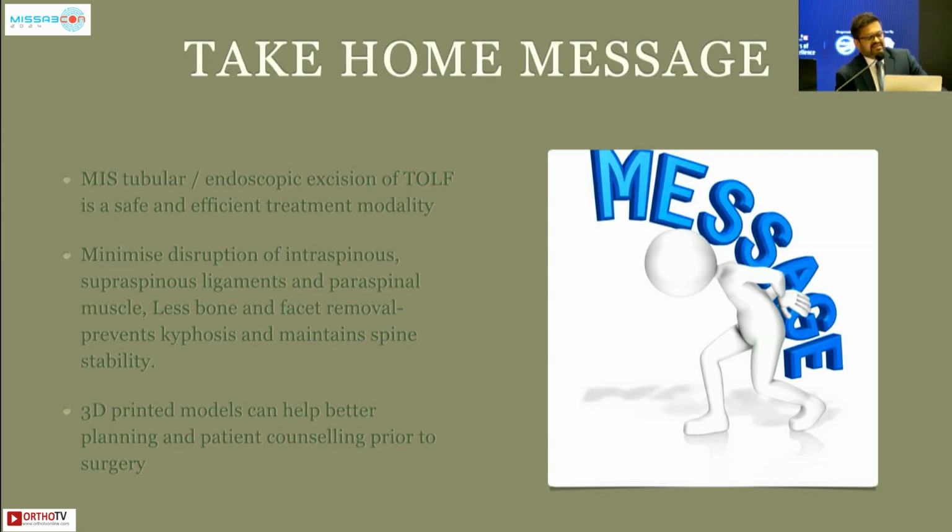The take-home message is that MIS tubular and endoscopic excision of thoracic ossified ligamentum flavum is a safe and efficient treatment modality. It minimizes disruption of intraspinous and supraspinous ligaments and paraspinous muscle, with less bone and facet removal, and hence prevents kyphosis and maintains spine stability. 3D printing models can help with better planning and patient counseling prior to surgery.